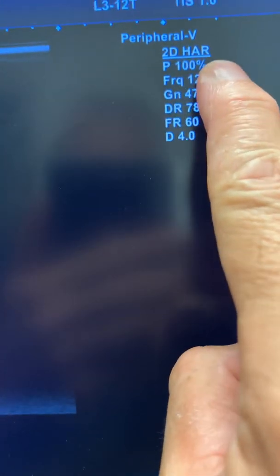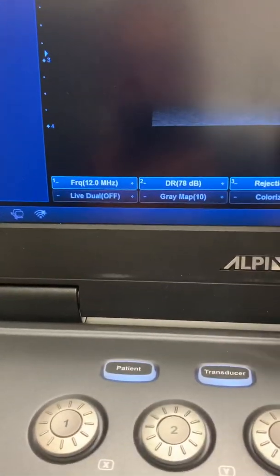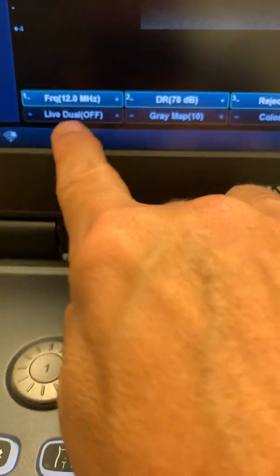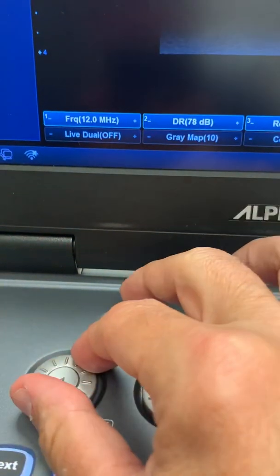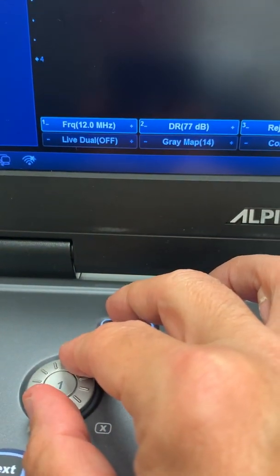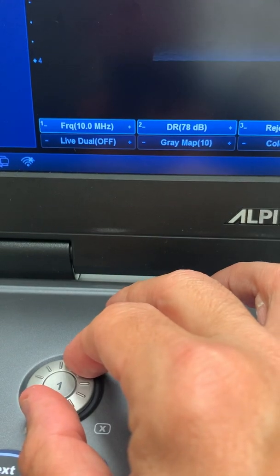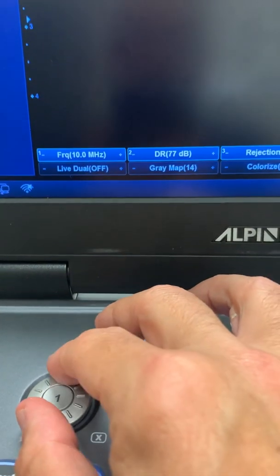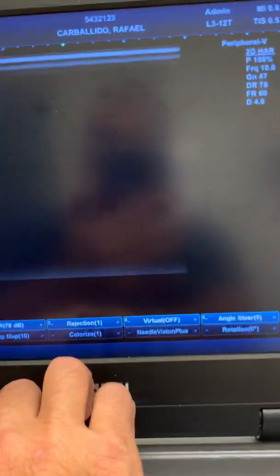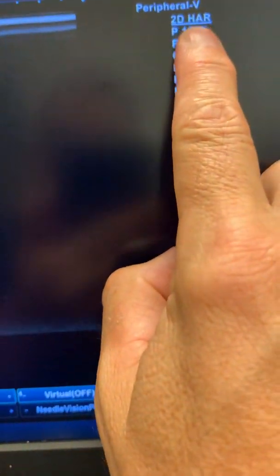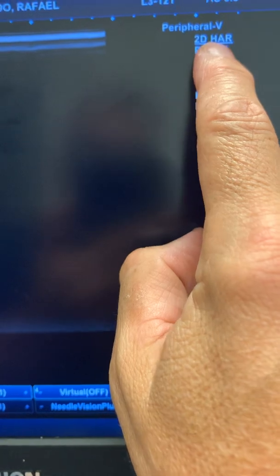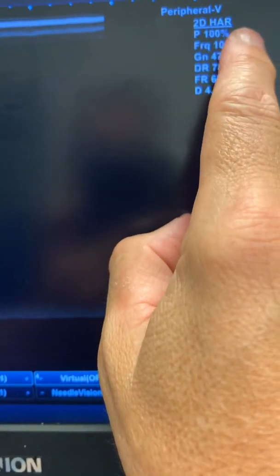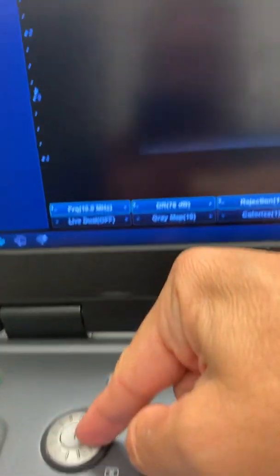When you click there, you see H A R - that means the machine is doing harmonic imaging now. In this menu here, controlled by knob number one, you can actually change the frequency for the harmonic imaging. So that would be 10, and this is H A R which is the second harmonic, tissue harmonic imaging.